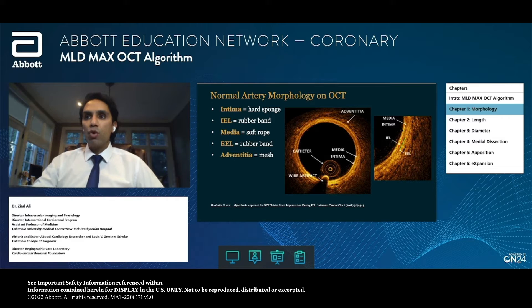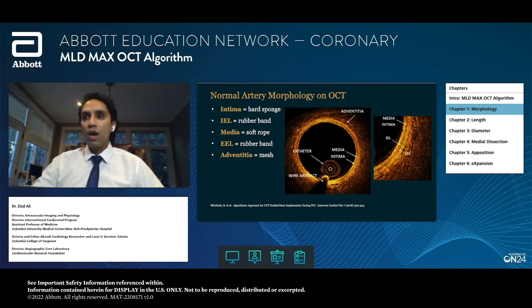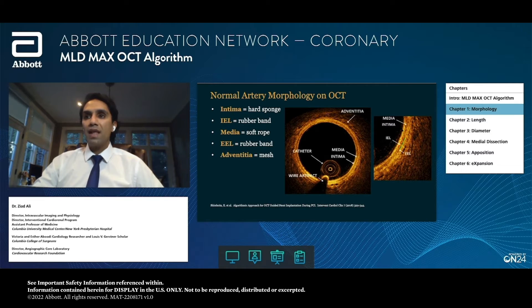The innermost layer or intima — this hard sponge — is this bright orange layer. Immediately under this layer is a darker, hazy black layer, which is actually the media or the soft rope. This is bounded on the inside, denoted by the red hash, and on the outside by the green hash — the internal and external elastic lamina respectively. You'll also see outside of the artery a mesh-type or hazy appearance, which is the adventitia.